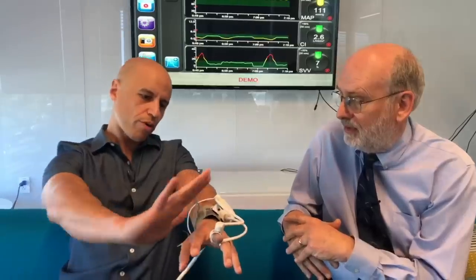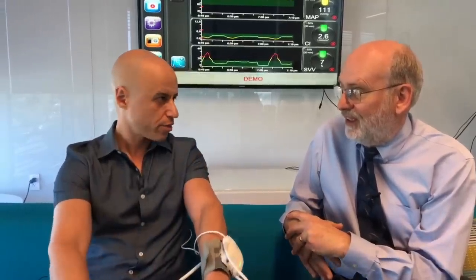And so what it does is it has a blood pressure cuff that basically inflates every time the pulse comes down the finger. Oh. And so that's basically an exact reflection of the blood pressure. Exact in real time. But it's a peripheral measurement, so is it affected by pressors, agents we use to raise blood pressure? Is it affected by peripheral vascular disease, things like that? Math is involved. Got it.